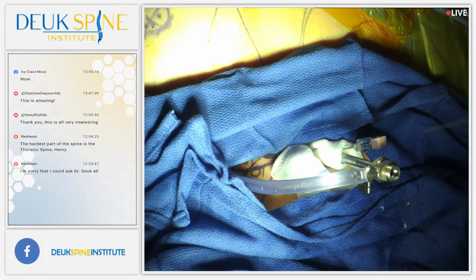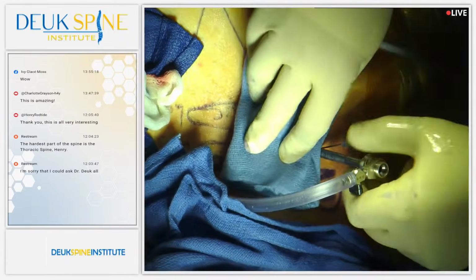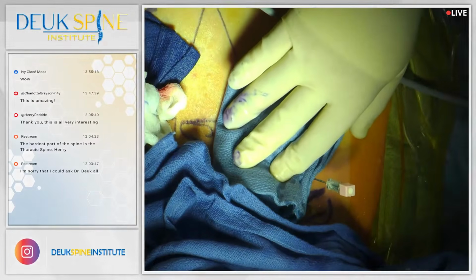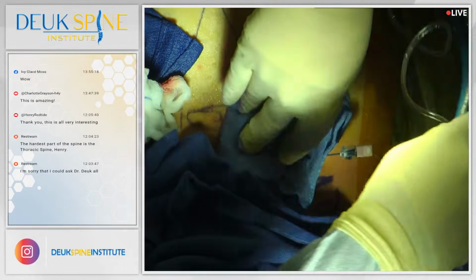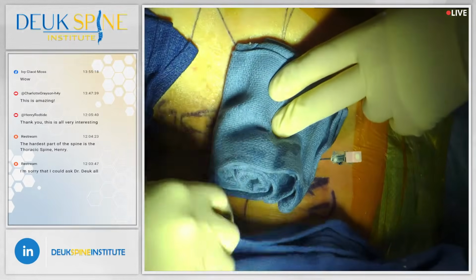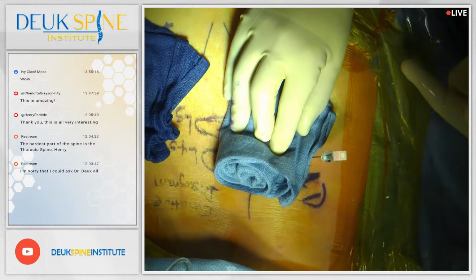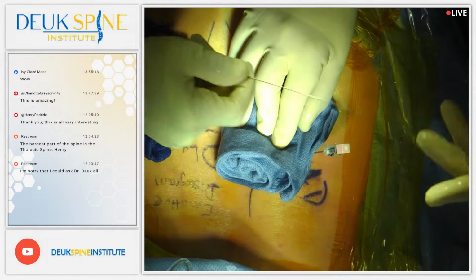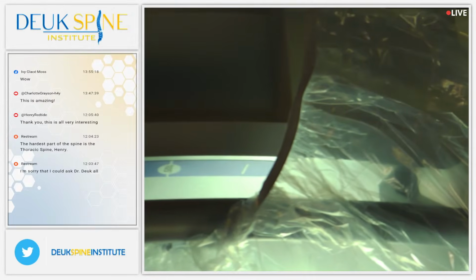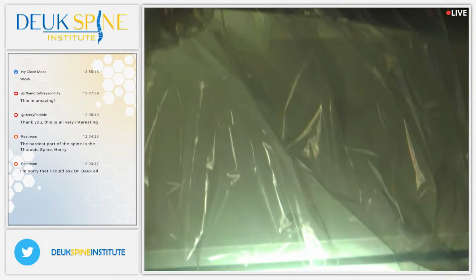That machine puts out a medical grade laser energy, laser beam, which we use to remove bad tissue around the disc tear, the annular tear. We call it a debridement of the tear, removing calcium deposit, herniated nucleus, scar tissue, abnormal nerve bundles and blood vessels, inflammatory tissue, granulation tissue, bone spurs.